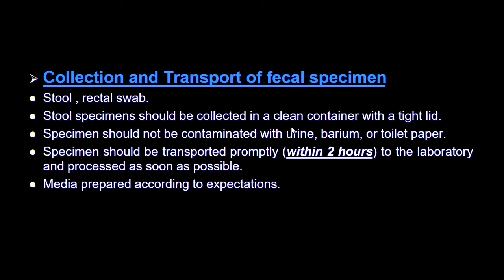Very, very important. The container has to be clean, because it could be contaminated with other agents, and it has to be covered with a tight lid, because if it is loose, it could be contaminated with microorganisms and give you false positive results.